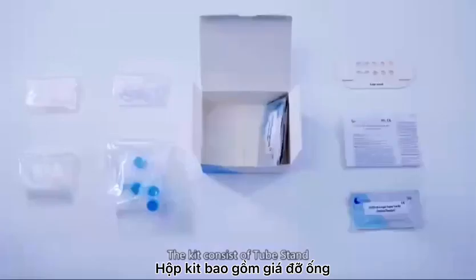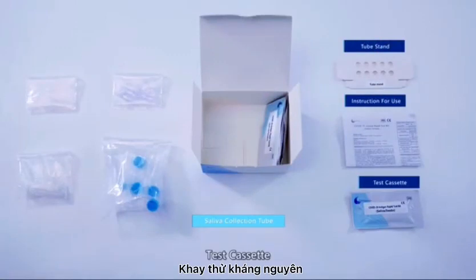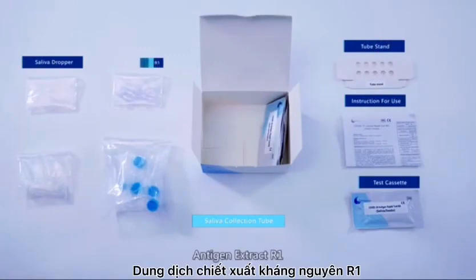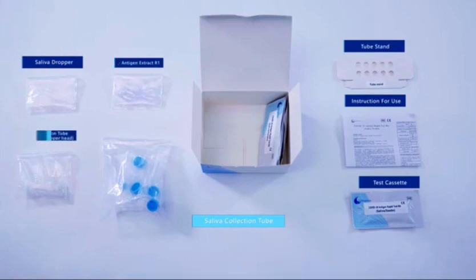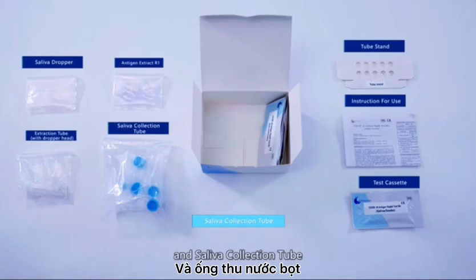The kit consists of tube stand, instruction for use, test cassette, saliva dropper, antigen extract R1, extraction tube with dropper head, and saliva collection tube.